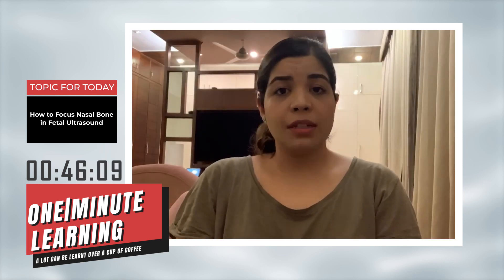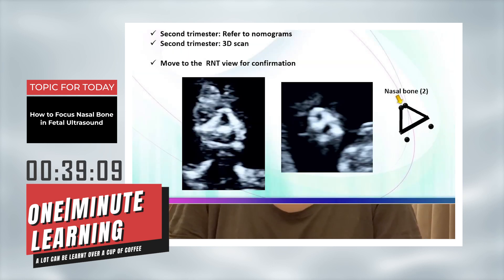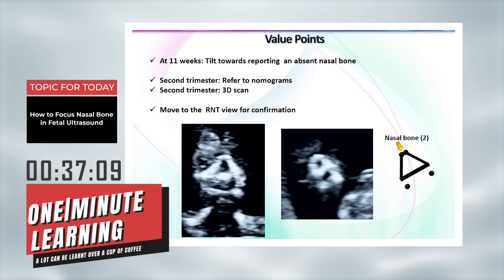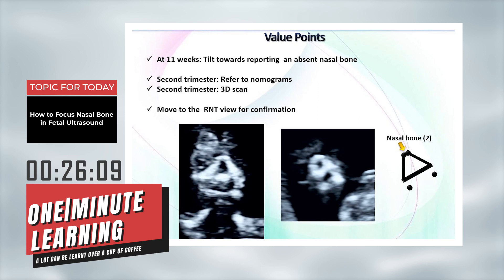To ascertain the presence of nasal bone in the first trimester, we can move from the classic mid-sagittal view to the coronal view where we see the retronasal triangle. In this view, we see two echogenic dots that represent the nasal bone, and they so-called cap the retronasal triangle.